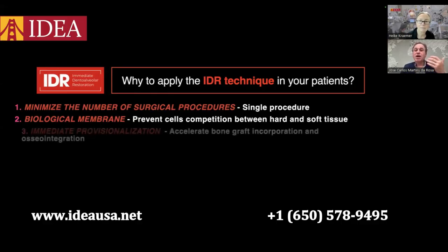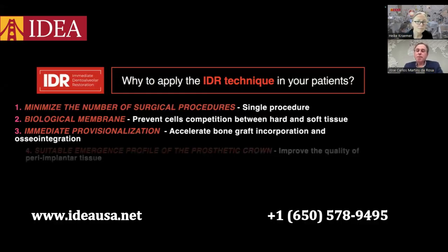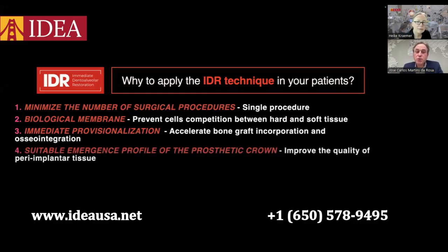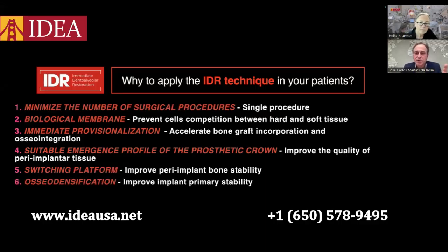Number 3, when we combine it with immediate provisionalization, we are able to promote an acceleration of the bone graft incorporation and osseointegration. When we manufacture the provisional restoration with ideal emergence profile, we improve the quality of the peri-implant tissue. When we use a platform switching implant, we improve the peri-implant bone stability. And when we use osseodensification, we improve implant primary stability.